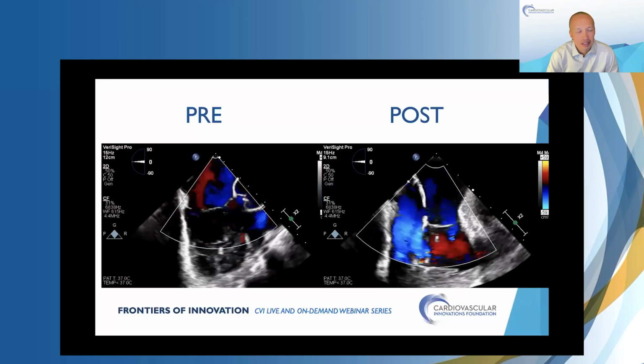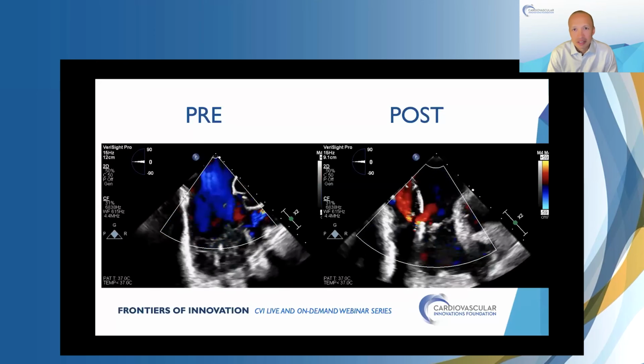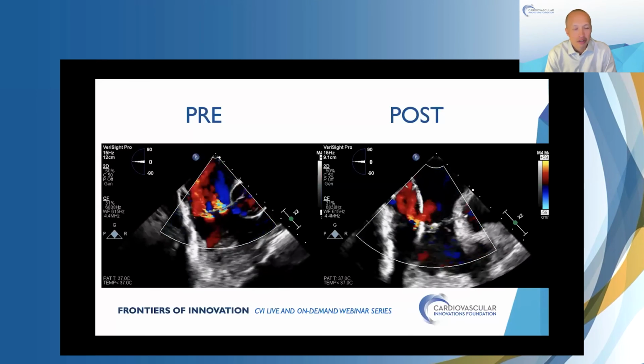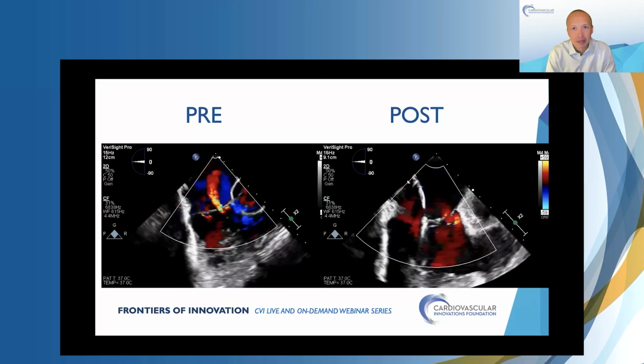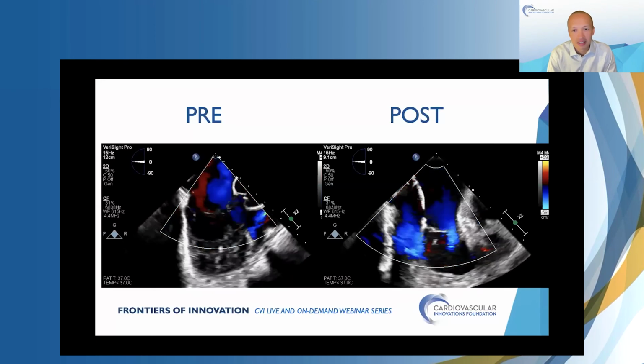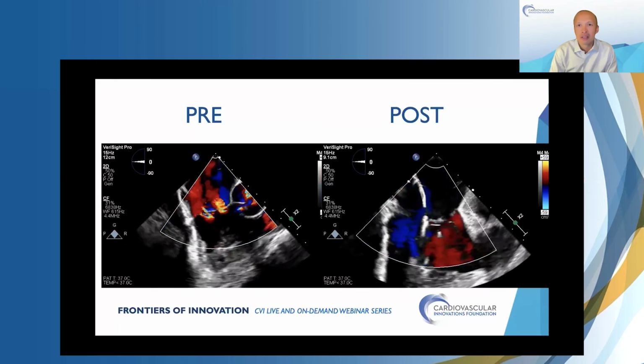I'll tell you that in the tricuspid space, because of the multiple coaptation planes, the need for this is magnified, because the planes are just all over the place. And depending on the trajectory of the IVC and where it's located in terms of offset, this 3D nav is just so important.